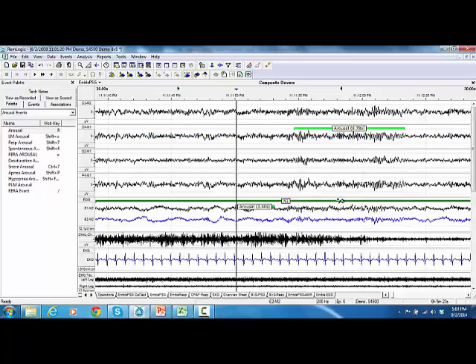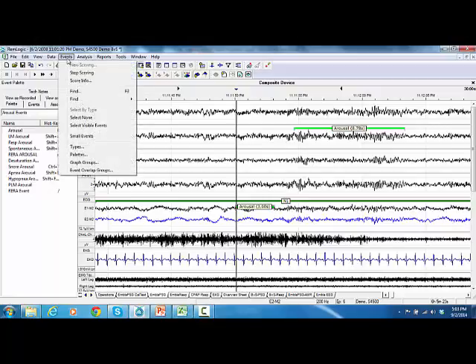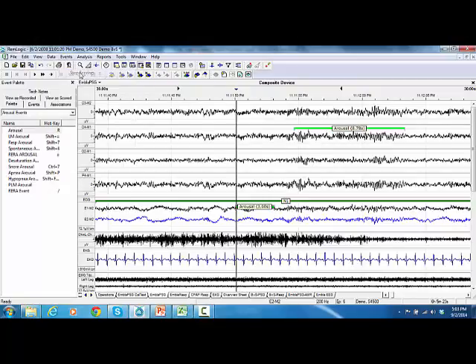Once you finish your scoring, go to Events and select Stop Scoring. Manual scoring for sleep stages and arousals is finalized.